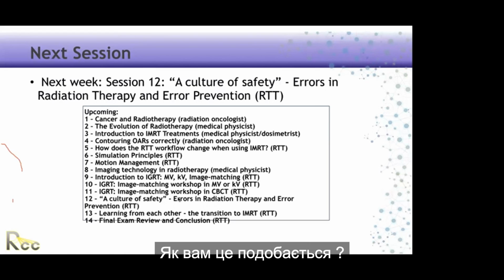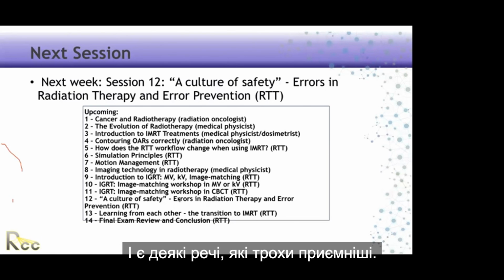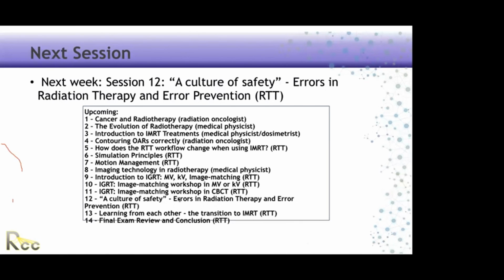How do you like the Halcyon? Fast. Very few MLC breakages. But I've been working with a Clinac for a number of years, and there are some things that are a little bit nicer. It holds your hand a little bit more.